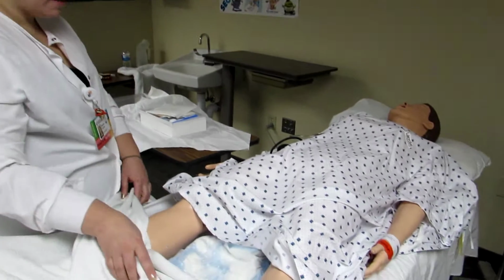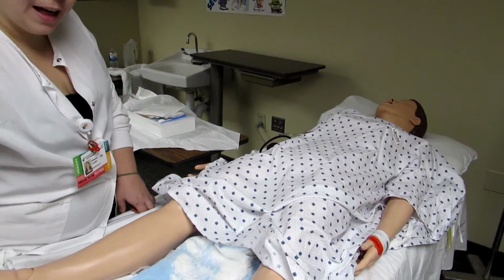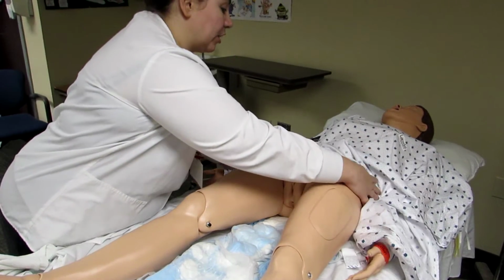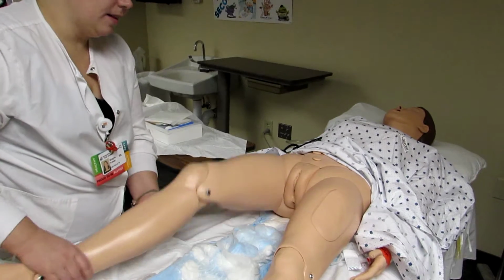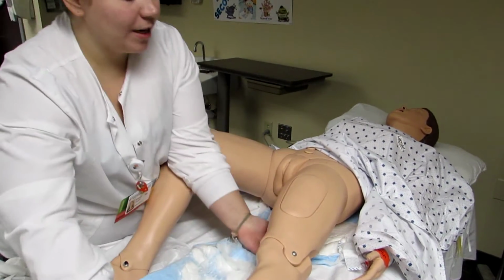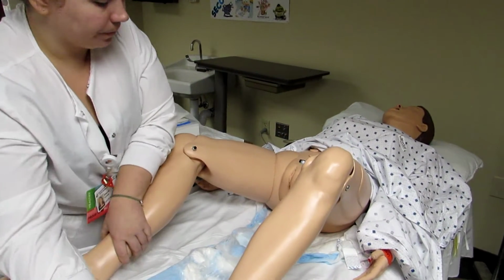Remember, if your patient is confused or elderly, you may need to get a couple of people to help you hold legs. You might need someone to get a flashlight to help you find the area, especially in a female. You're going to bend the legs up and out. Our mannequin doesn't do it as well as hopefully your patient will be able to in the clinical setting. We're going to do the best that we can here.